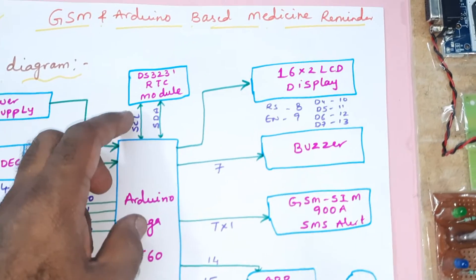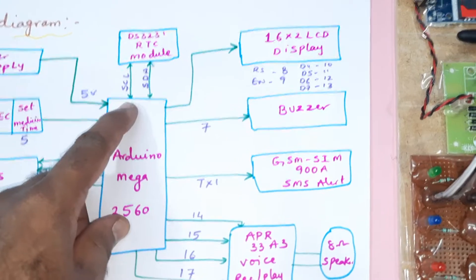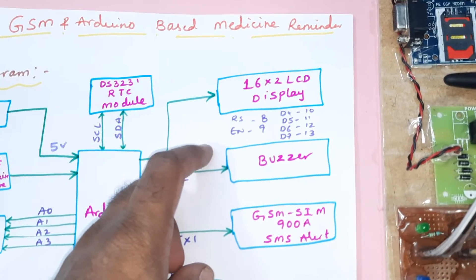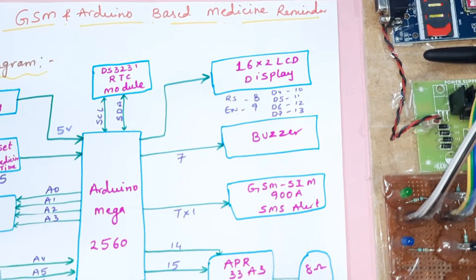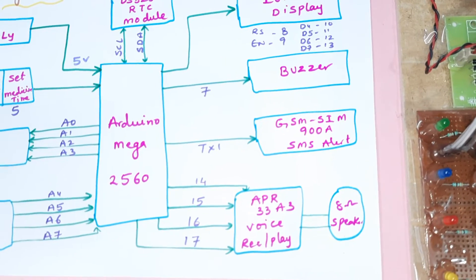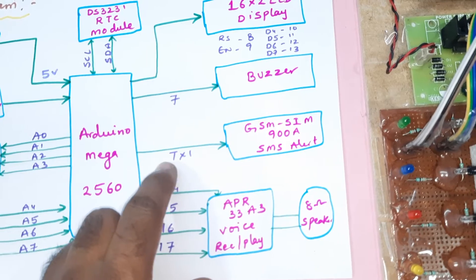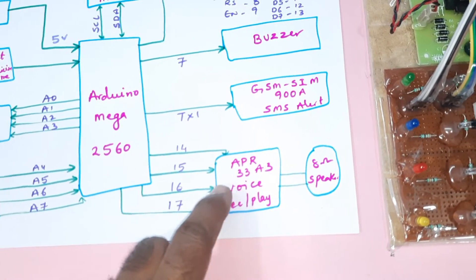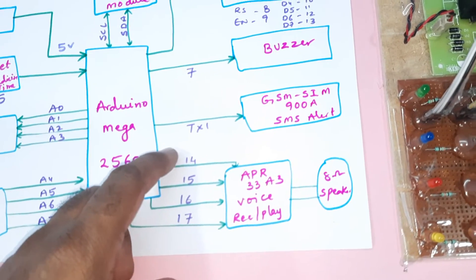5 volts power supply. The DS3231 RTC module is connected via I2C protocol using SCL and SDA. The 16x2 LCD display is connected with RS, enable, D4, D5, D6, D7 on pins 8, 9, 10, 11, 12, 13. The alarm is on pin 7. The GSM SIM800A module is connected via TX1 serial communication. The APR33A3 voice record and playback IC is connected with pins 14, 15.